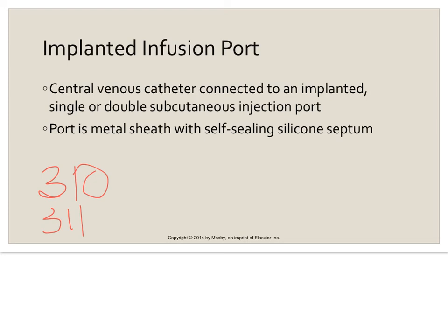But an implanted infusion device is a device where the patient has to either go down to interventional radiology or to the OR. You actually take a port.